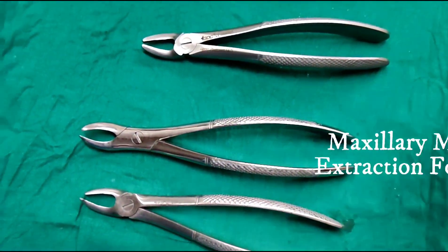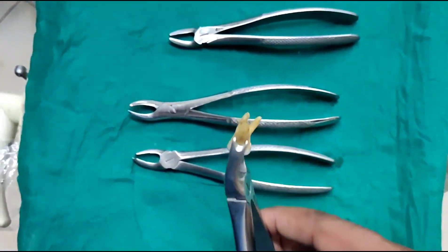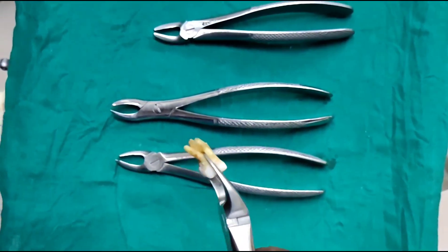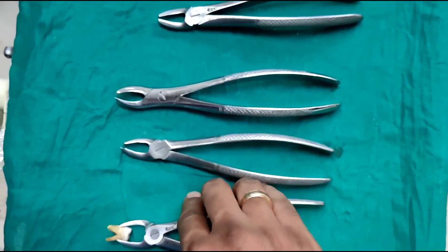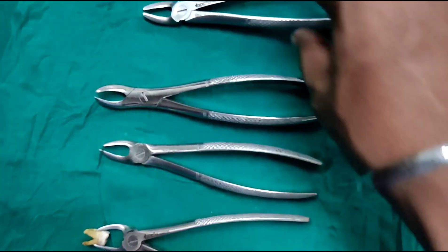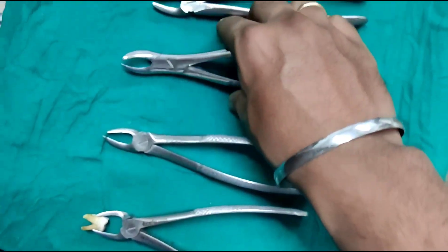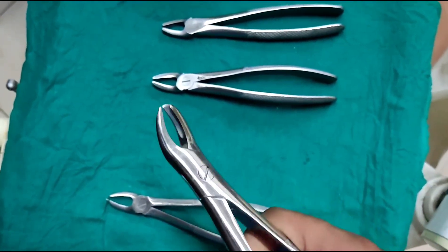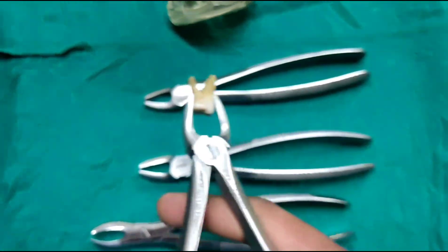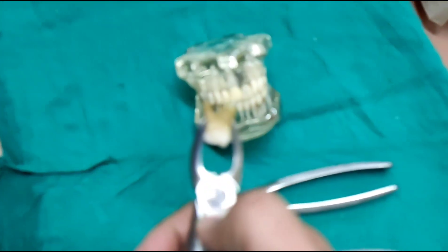Now coming to the molar forceps. The maxillary molars have three roots: one is the palatal root, and two are the buccal roots — the mesiobuccal and the distobuccal. To engage or have a grip on the teeth, the buccal side has to have a proper grip. The molar forceps, because it has two roots on the buccal side and one root on the palatal side, is designed accordingly.